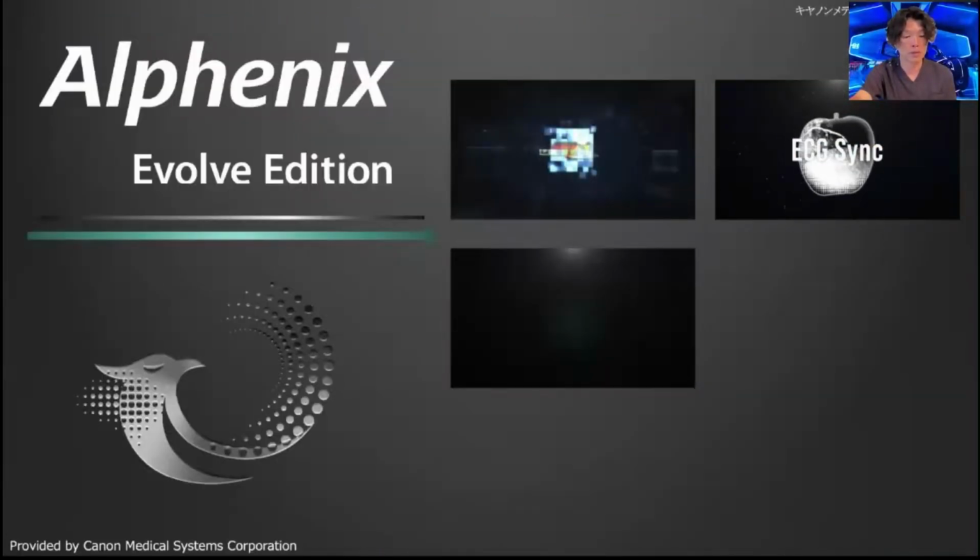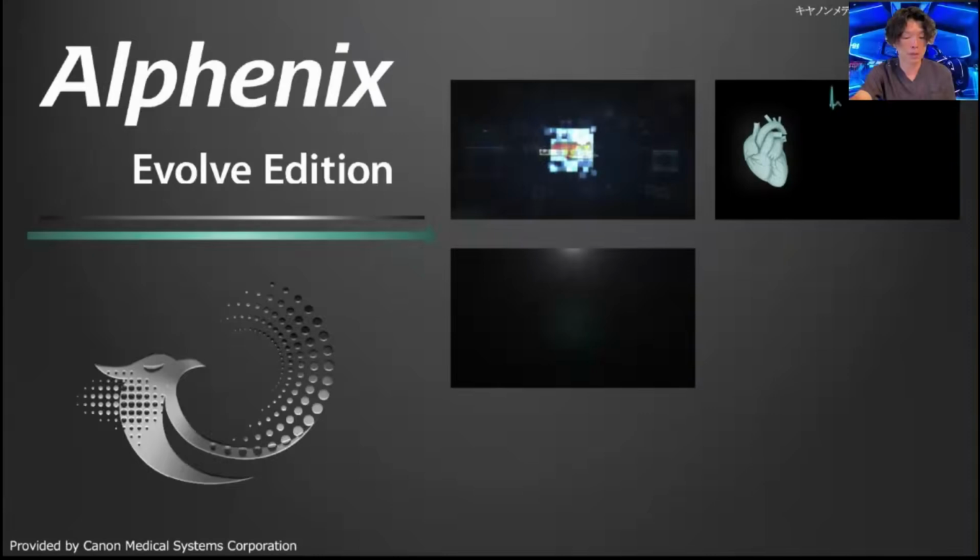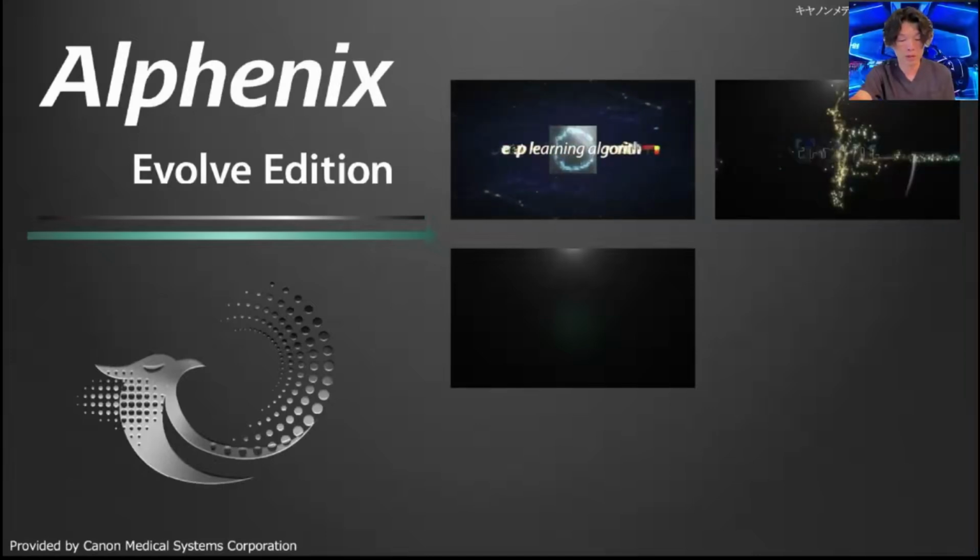The Canon Alphenix Evolve Edition is a state-of-the-art angiography system designed to meet the advanced needs of interventional cardiology and radiology. This cutting-edge platform provides outstanding image quality and flexible system configuration, with innovative dose reduction technologies to support complex procedures with safety and precision. It delivers high resolution images and advanced imaging algorithms, allowing for precise visualization of vascular structures and devices.